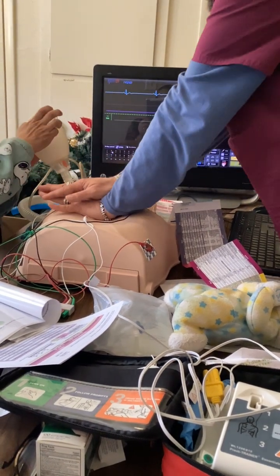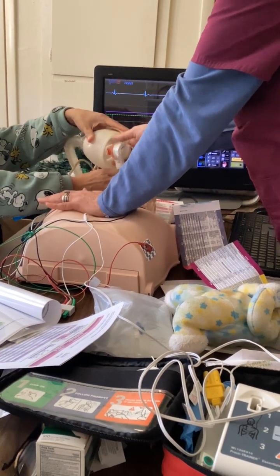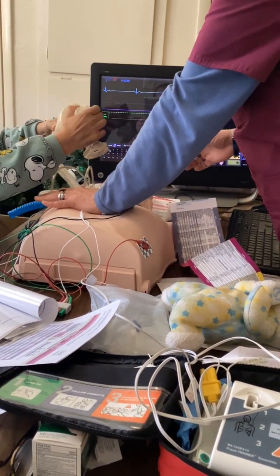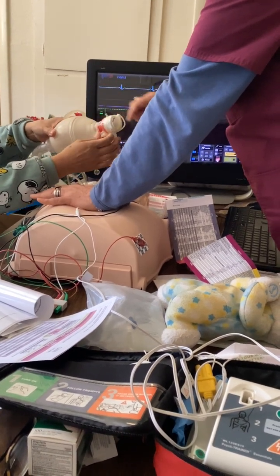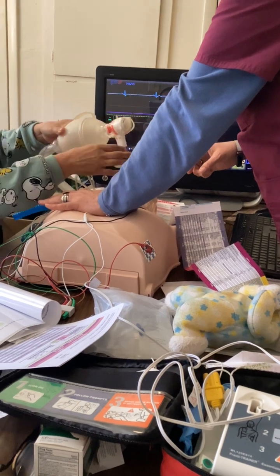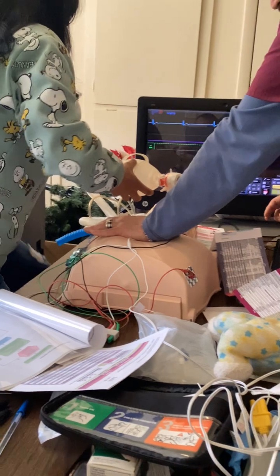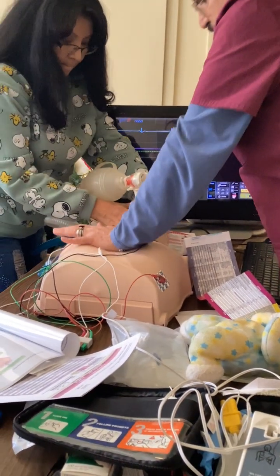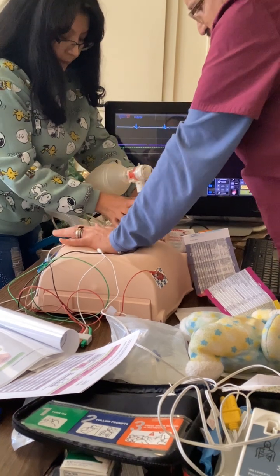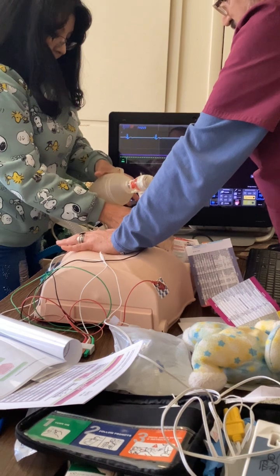So I'm going 15 to 2. 1, 2, 3, 4, 5, 6, 7, 8, 9, 10. Pull that out all the way. And it has a pop-off feature, but make sure it's locked. Is it locked now? Yeah. Okay. So come up to the top of the head, so you're using the EC technique. Okay. 1, 2, 3, up to 15.